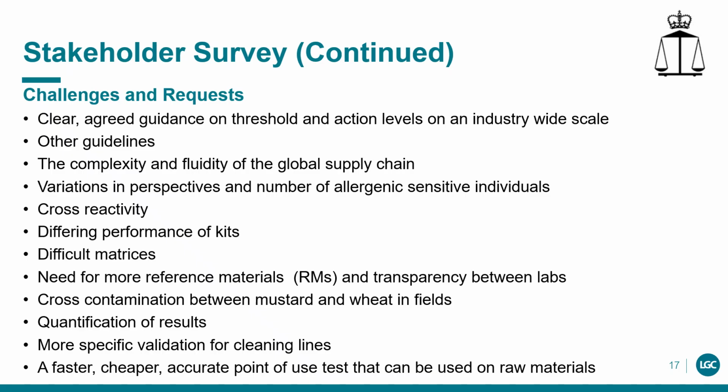The requirement for results to be quantified for comparison to VITAL limits was also highlighted, as results are not always quantifiable, especially those obtained using PCR. Additionally, validation of line cleaning procedures are not always specified, and testing cleaning lines for the presence of allergens may not accurately represent what is in the final product. A final point raised was that numerous companies are looking for more cost-effective, rapid approaches for testing, particularly in terms of point-of-test capability.